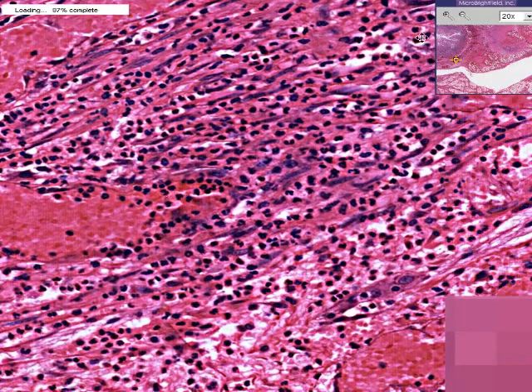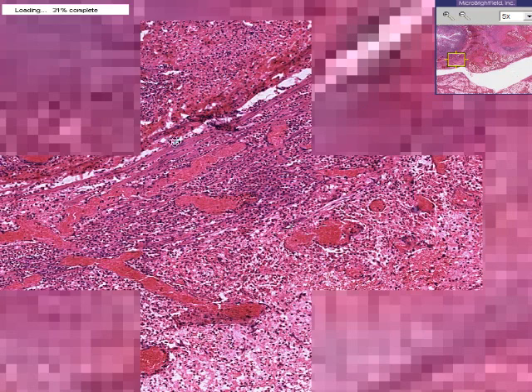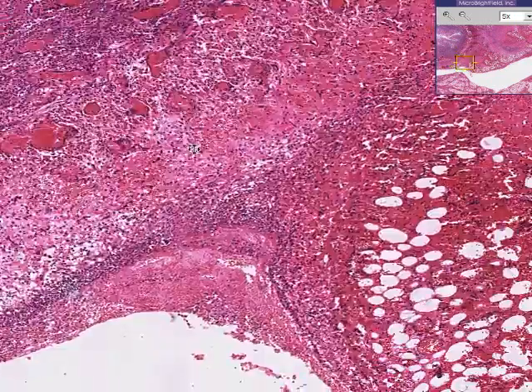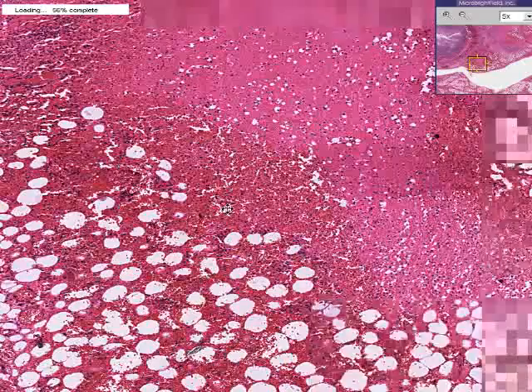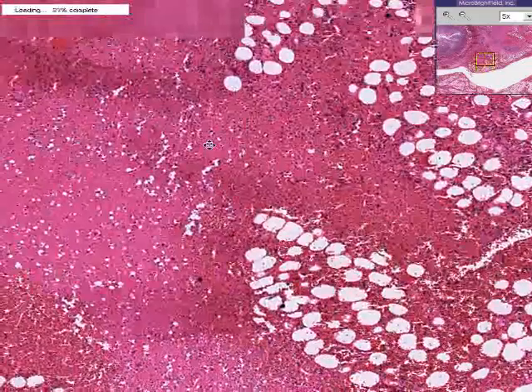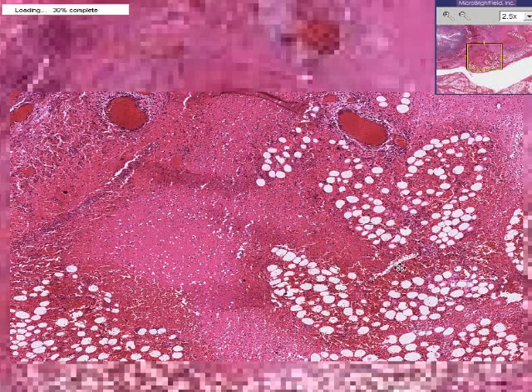layer is gone, and for this reason there is a significant amount of this acute inflammatory destructive process extending through the serosa and into the surrounding fat. And in addition, there is a fairly localized collection of these neutrophils within the fat, a so-called periappendiceal abscess.